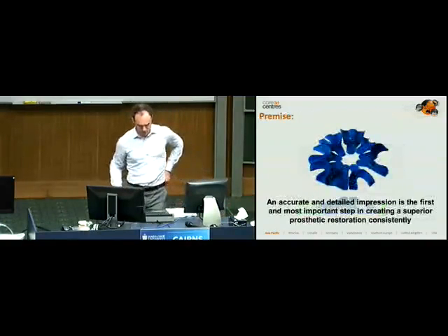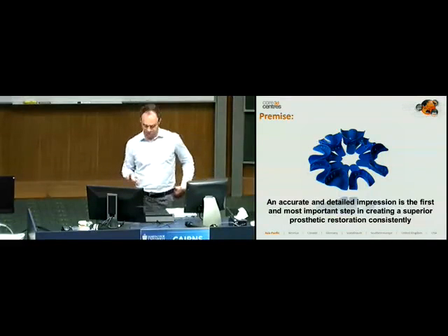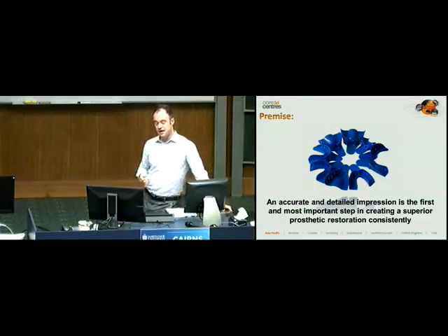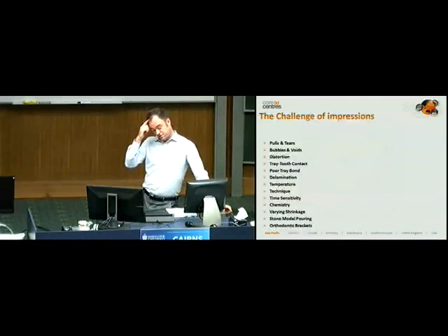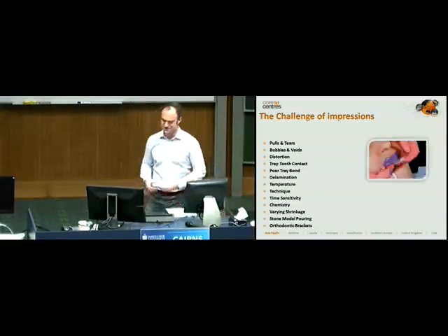So where are we at right now? Believe it or not, you already know this: the impression is the most important part of your treatment plan. Without a good impression, it's difficult to get a good final result for the patient. An impression is inherently difficult to take, and it's difficult to get it consistent every time. The main challenges faced by everyone in this room and beyond are multiple problems: pulls and tears, distortion, temperature, technique, chemistry, you're having a bad day. All of those things are problematic. And of course, the mess of an impression.